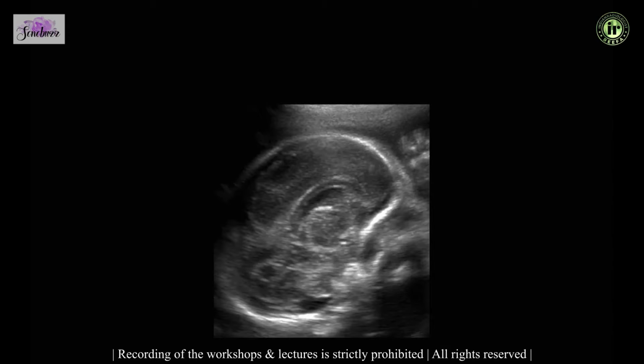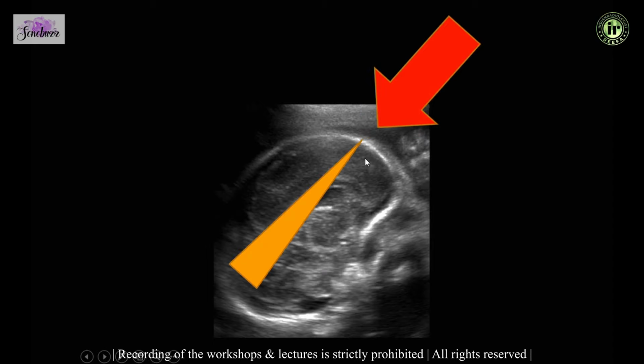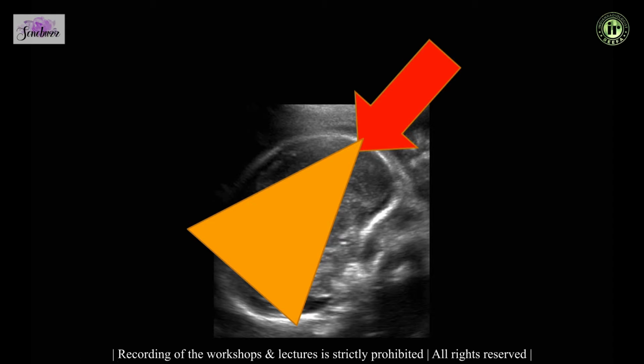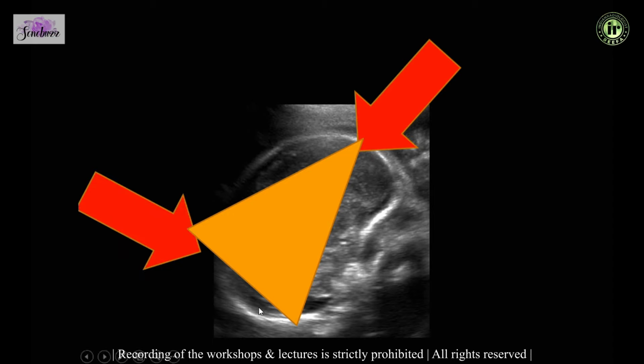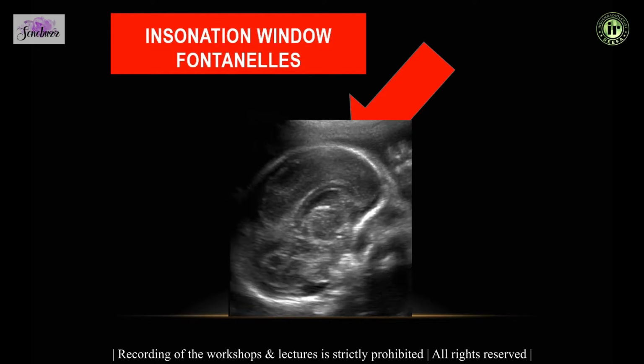Advanced neurosonography involves visualizing multiple sections either through the anterior fontanelle or through the posterior fontanelle, and we press the transducer at the level of the fontanelle, either with the transvaginal transducer or, if it's a breech, transabdominally. So you use whichever fontanelle, but preferably the posterior cranial fossa is better visualized from the posterior fontanelle, and the anterior cranial fossa from the anterior fontanelle, as you can see.